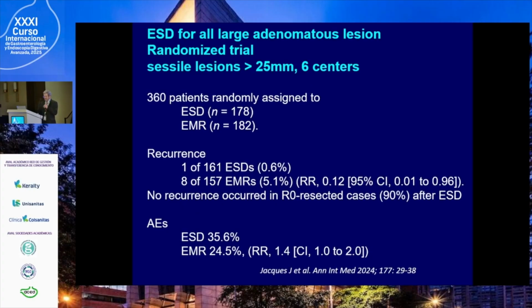And personally, I think we should not totally rely on all these classifications, okay? These classifications are helpful, but they are not perfect. So LST classification, NICE classification, JNET classification, Paris classification, they are not perfect. So that's why in my unit, we do ESD. We do ESD. And I'm sure in 10 years, everybody will do ESD.